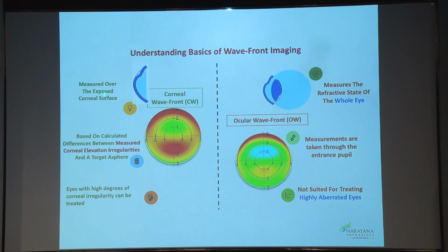99% of people are doing laser based on this only, because there are not many good corneal wavefront guided treatments available in the country, except for the pyramidal system from Schwind. If you can go back to the next slide.